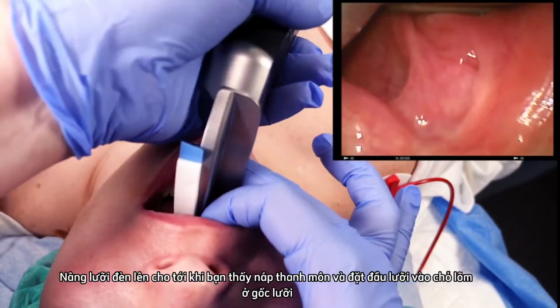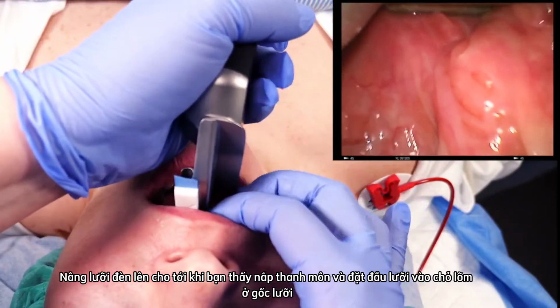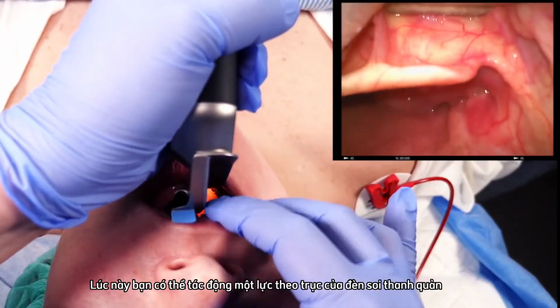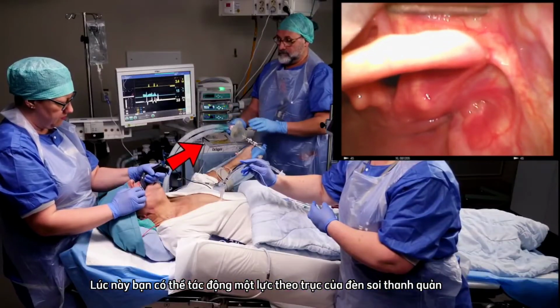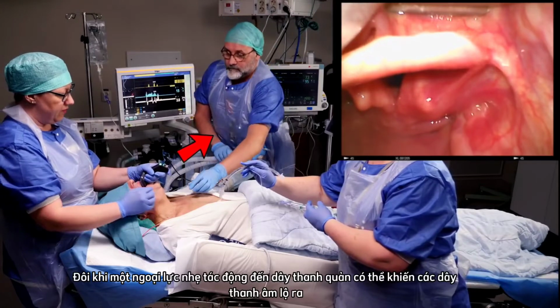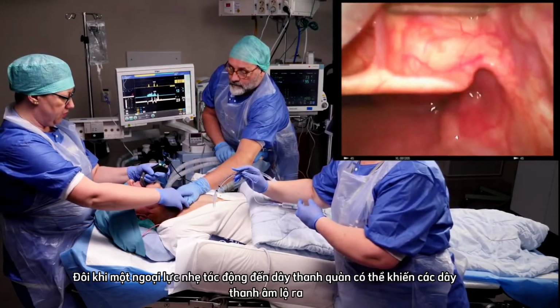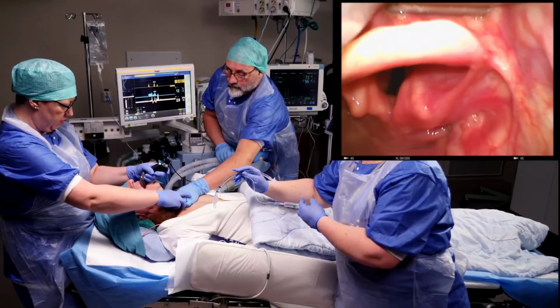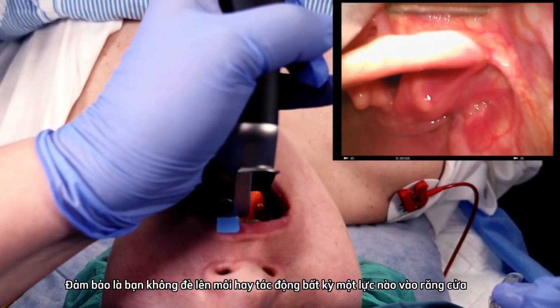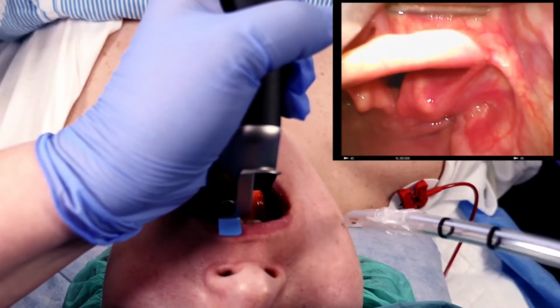Advance the blade until you see the epiglottis and place the tip in the vallecula, the recess at the base of the tongue. At this point, you can start to apply some force in the direction of the laryngoscope shaft. Sometimes a light external force on the larynx can make the vocal cords spring into view. Make sure you don't pinch the lips and do not exert any pressure on the front incisors.